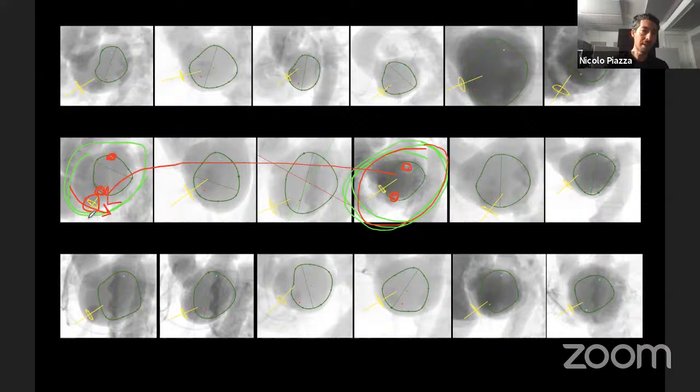Okay, notice that here you have a perfect line from commissure to commissure, whereas here the commissure is actually found behind. And so that also brings up the point of when you do cardiobands or other procedures, that where you puncture and where you have to wrap around and come back on yourselves might be different from patient to patient.